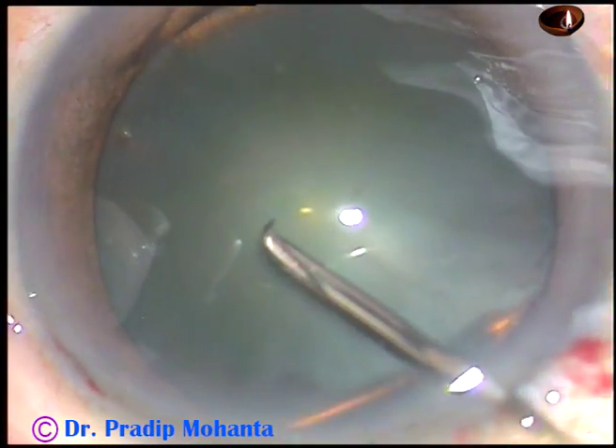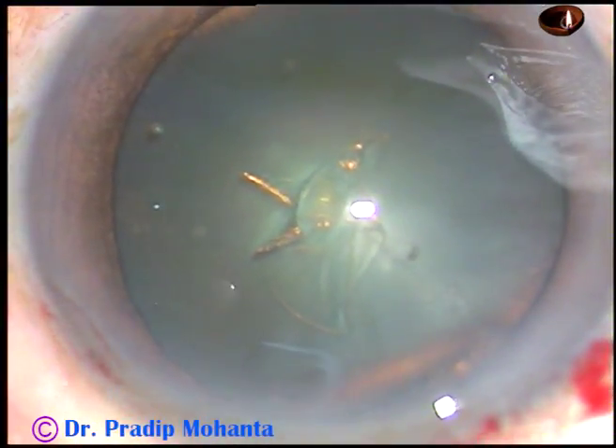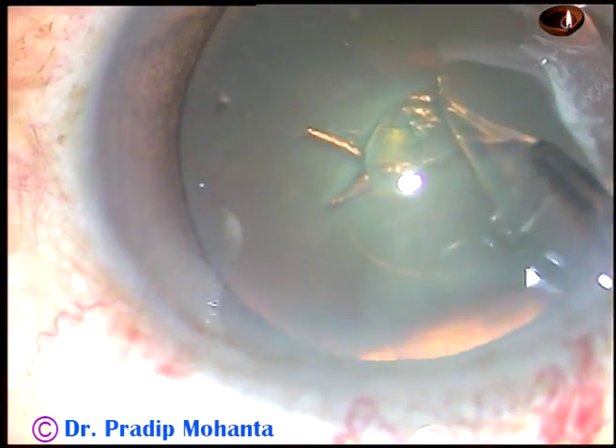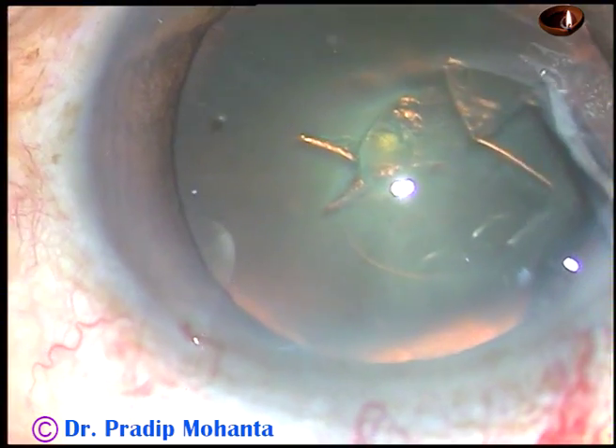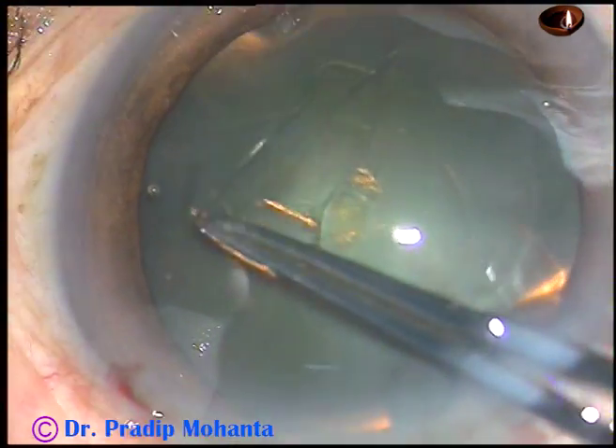A 26-gauge bent needle is used to raise a capsular tag. I hold this capsular tag with a Utrata forceps and go anti-clockwise, remaining at a certain distance away from the margin of the dilated pupil.